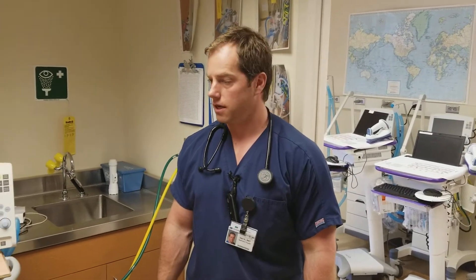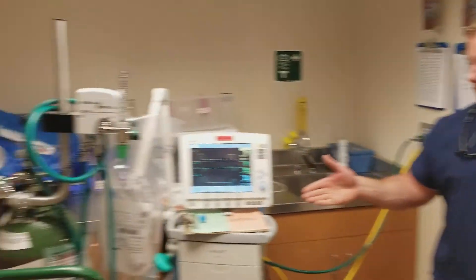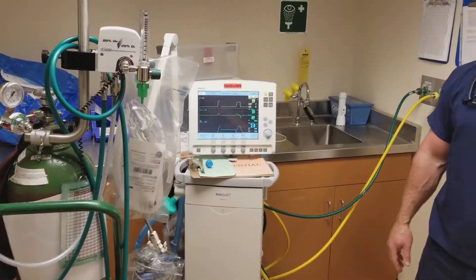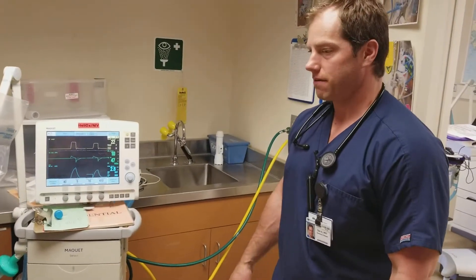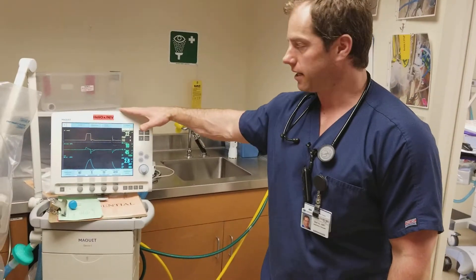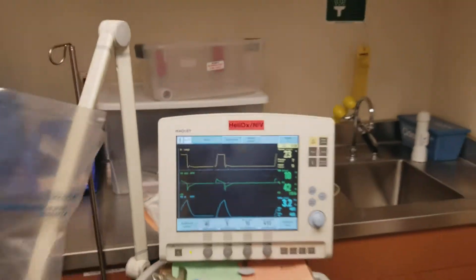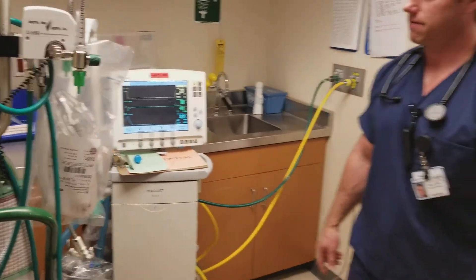This is a video to demonstrate putting helium into the ventilator for Heliox use. First, you want to make sure you have everything you need, including a Heliox-compatible ventilator, indicated by the red label that says Heliox and NIV on it.